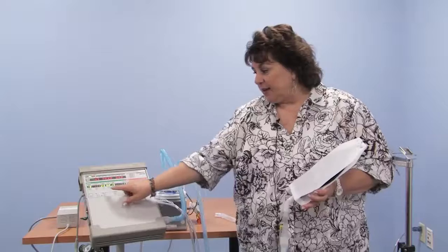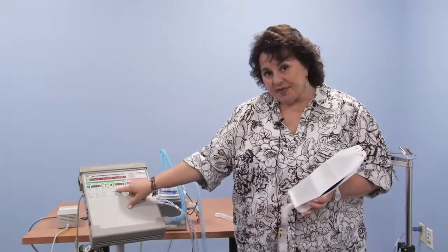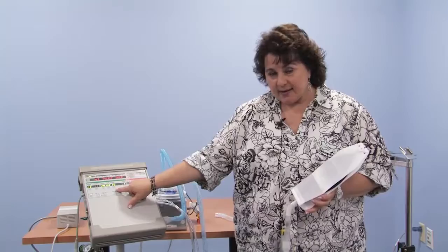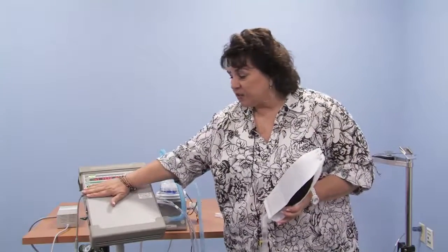How I set the pressure control, if ordered, how I set the pressure support, if ordered, and where I measure what the right number is. So if your PEEP is external on the hoses, the machine does not know how much you set, and that cuts into the amount of pressure on the machine. So for these exact settings on the 950, this is up to 20 and down to 5, a difference of 15. This is up to 15 and down to 5, a difference of 10. On the 1150, as I'll show you in a moment, we will be setting the difference and not the top number. Everything else will look the same.